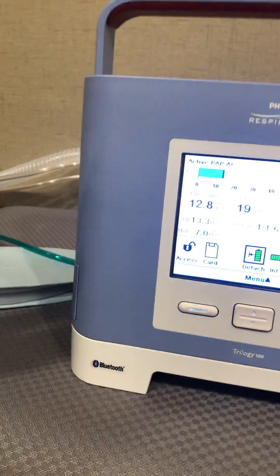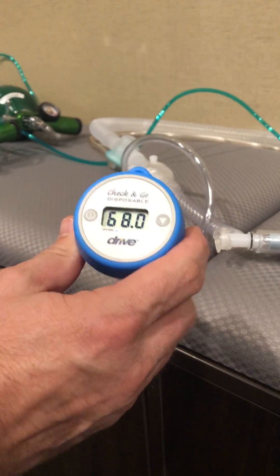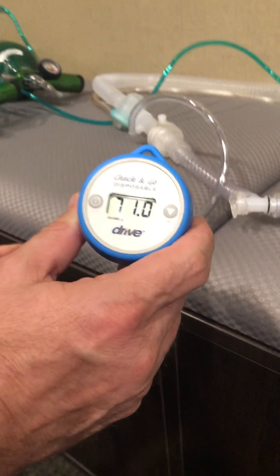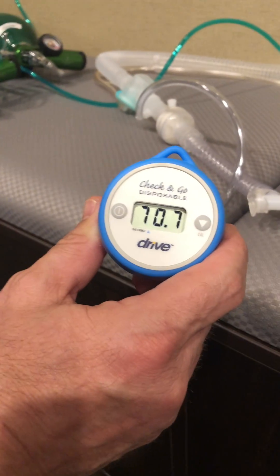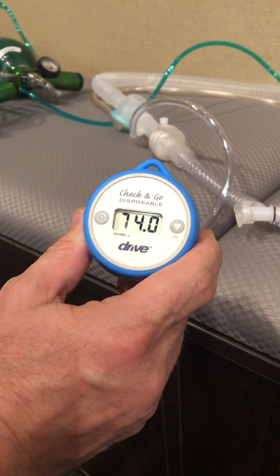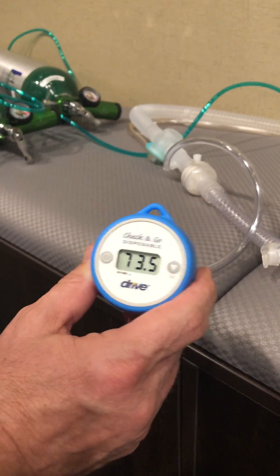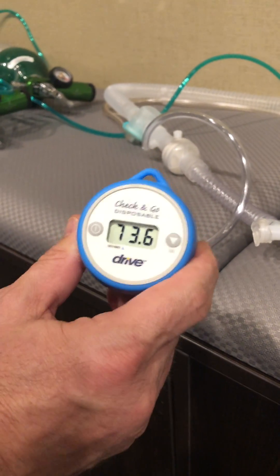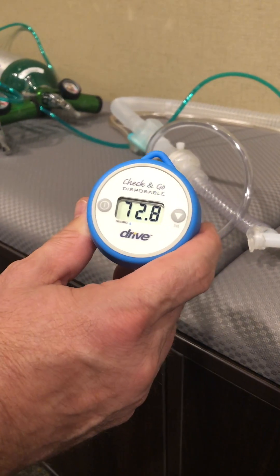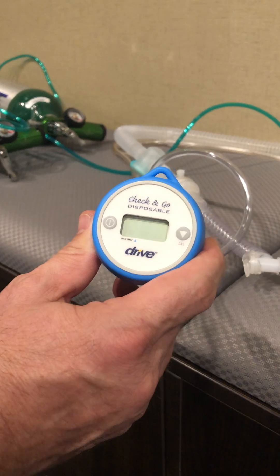We've got our oxygen analyzer in line, very close to the patient, right next to the HME. These are approximate values since we are on a test lung at this time. As you can see, we're leveling out at around 70% FiO2. We think that's a reasonable level — between 65 and 75, we'll call it 70 on average. We picked 16 liters because we have two 8-liter regulators at full capacity, which is close to what we'd get with an oxygen flow meter in a facility.